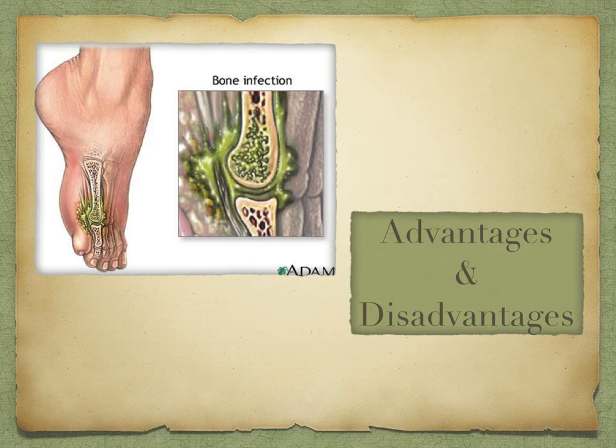Advantages. They have the ability to look over the entire human skeleton or selected parts. They can diagnose osteomyelitis 24 hours earlier than plain film. Disadvantages. They're not specific, need to correlate with plain film radiographs, poor resolution in many places, as well as they can have difficulty distinguishing different diseases from one another.